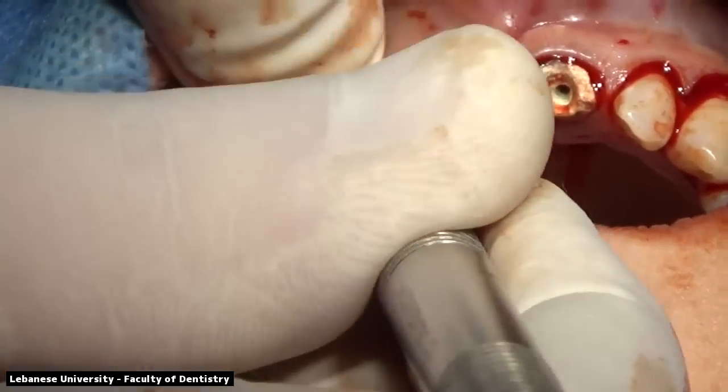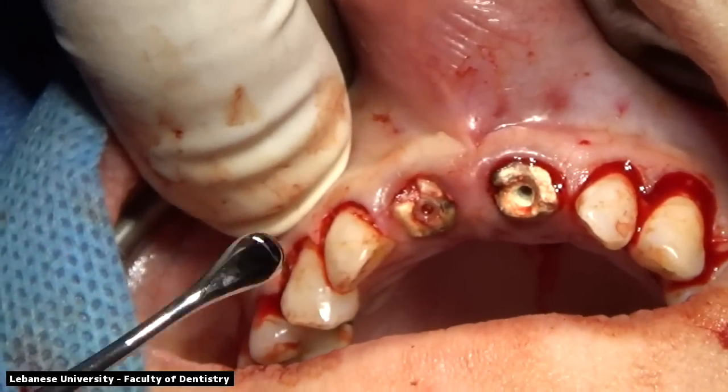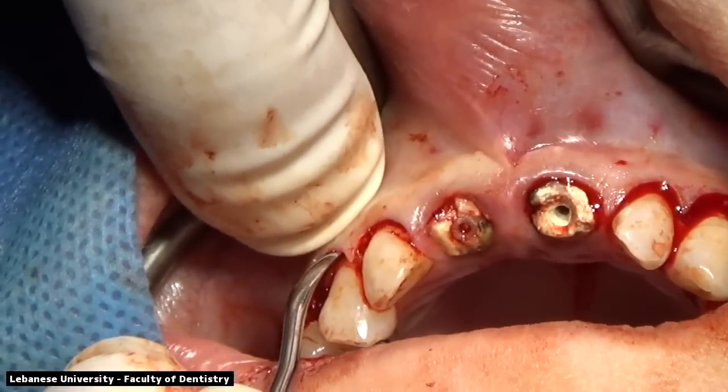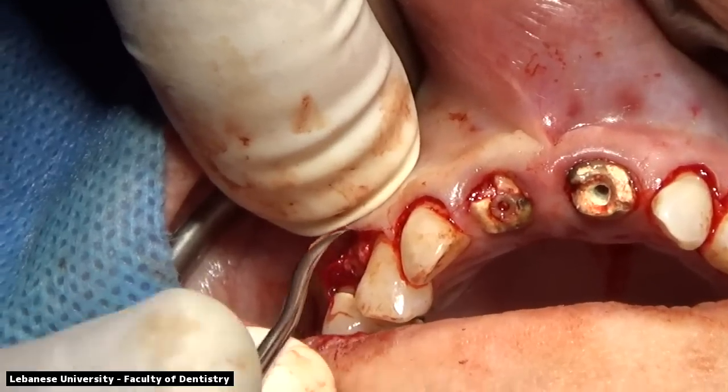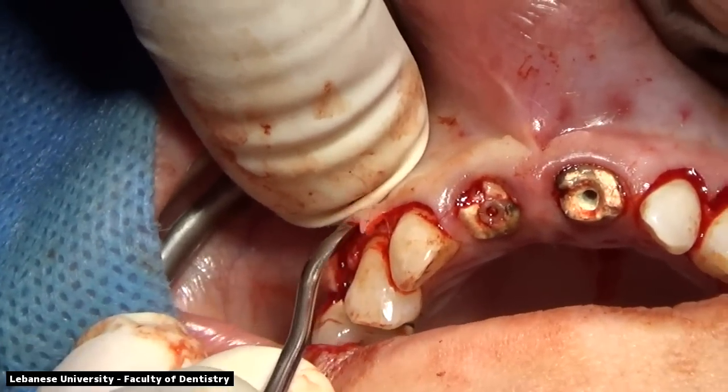We will start by elevating the papillas first, placing some pressure on the papillas with the fingers to avoid slippage of the periosteal elevator, to avoid tearing of the soft tissue.